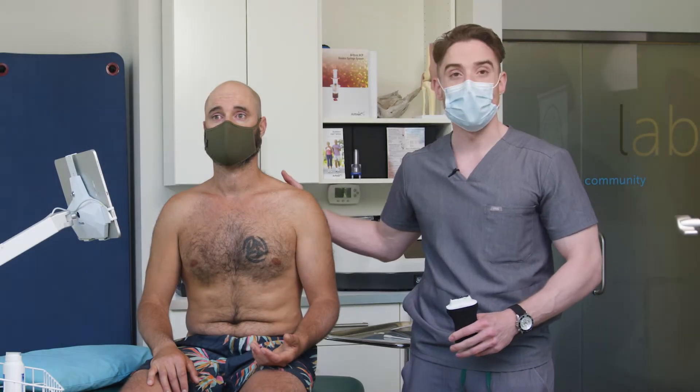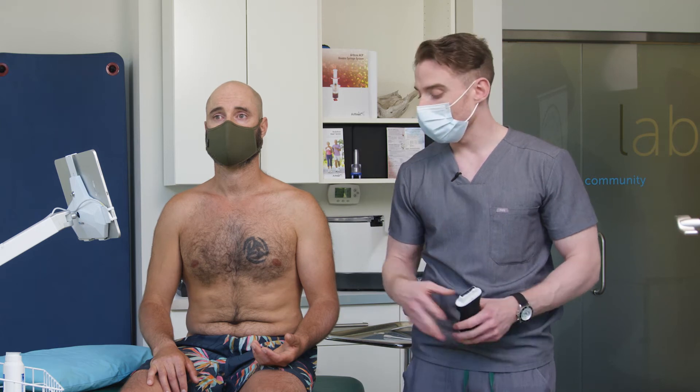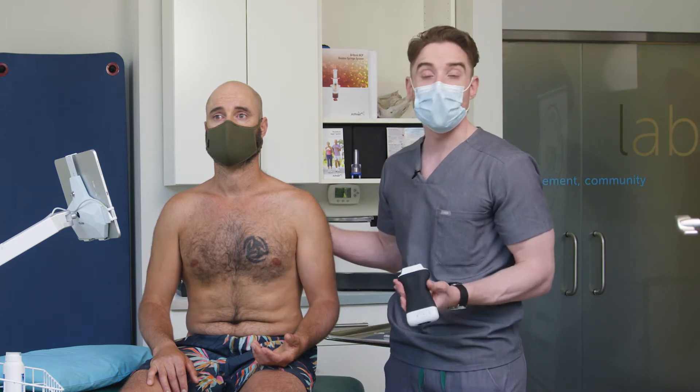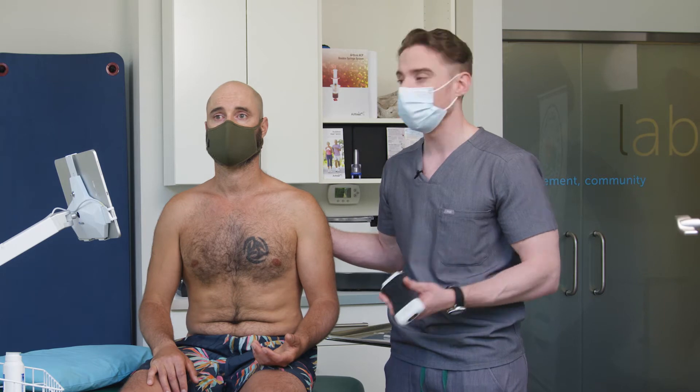Today, I have my patient Jaden here. We're going to be doing a rotator cuff exam on Jaden, and we're going to be assessing some of the structures in and around the shoulder as well. I'll be using the L7 wireless Clarius scanner.